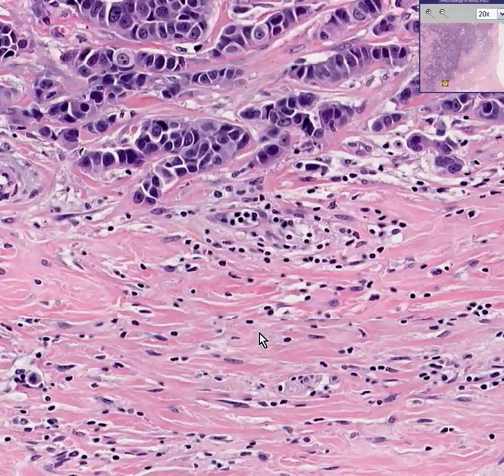In addition, all these little pinpoint cells here out within the fibrous tissue. Here's a fibroblast, here's a fibroblast, probably here is. But the little round cells are just scattered nests of lymphocytes, because like most tumors, the body wants to fight it with its own immune system, i.e. lymphocytes. So generally speaking, the more lymphocytes which cuff or battle or surround a tumor is often associated with a better prognosis than when these tumor cells just go out invading and there's no little soldiers out here to fight them. Thank you very much.